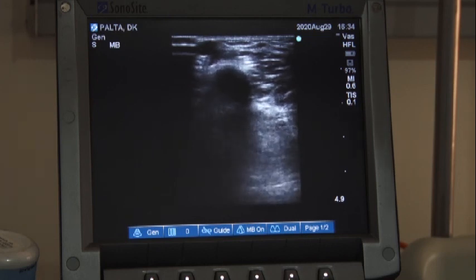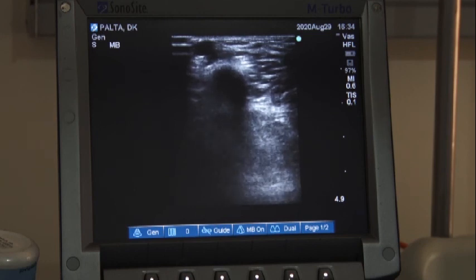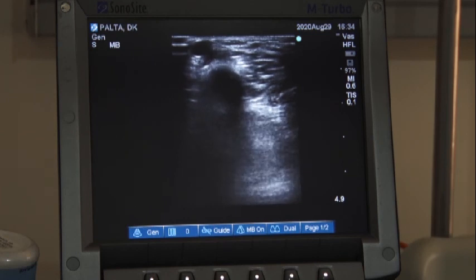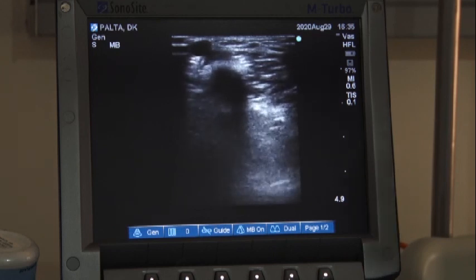Outflow, we have seen the body of the AVF and the outflow vein. The outflow vein is mainly the basilic vein of the arm, which is continuing as the axillary vein, with a patent internal jugular, brachiocephalic, and superior vena cava. We have seen that, and that ends my session. Okay.